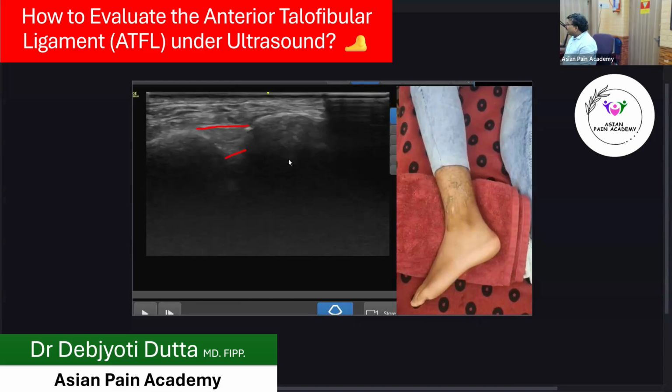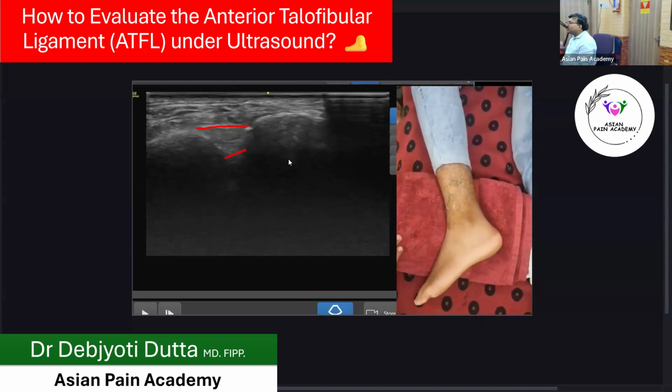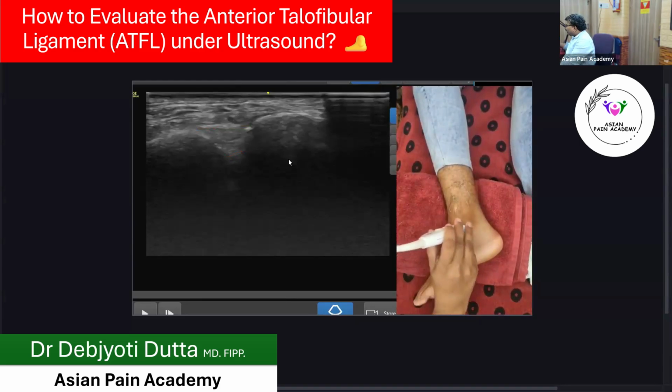So we have understood how to find the anterior inferior tibiofibular ligament. Remember, injury of this ligament is comparatively rare because it's a very strong ligament and it forms part of the mortise. Now, again, I am going back through the steps one by one.